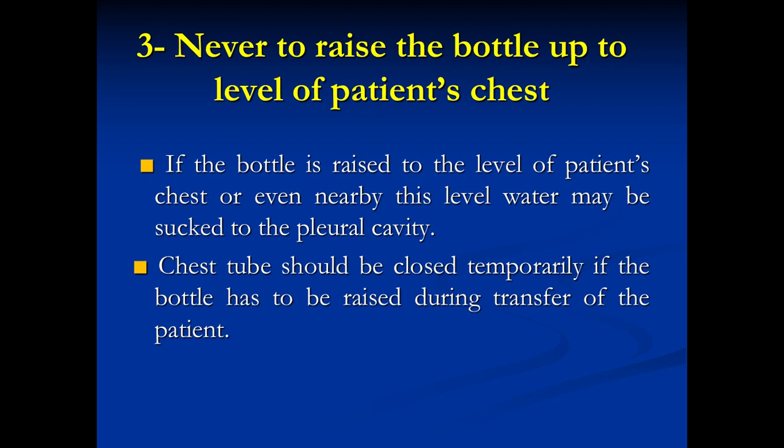The chest tube should be closed temporarily if you move the patient from one place to another, or if you have to raise the bottle during transfer of the patient. So it's closed during transfer for a few seconds, then you open it again.